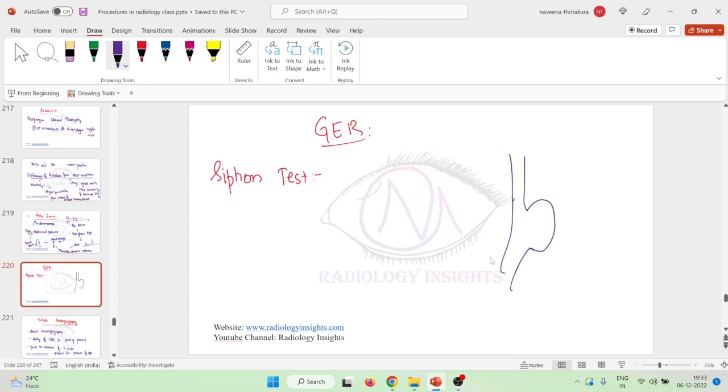So if this is the stomach, you will fill the stomach with 50% barium. And this 50% barium will account for around 150 to 200 ml. Okay, this is step number 1.